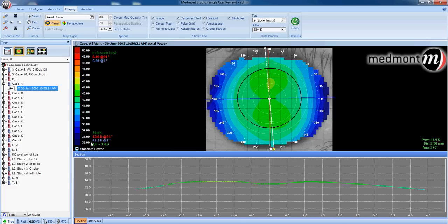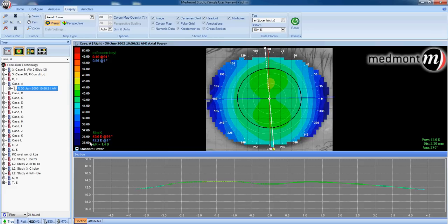Now we have a 15 diopter scale range that's absolute, absolute meaning it will always be from 50 to 35. And you can determine where that patient falls within that scale.